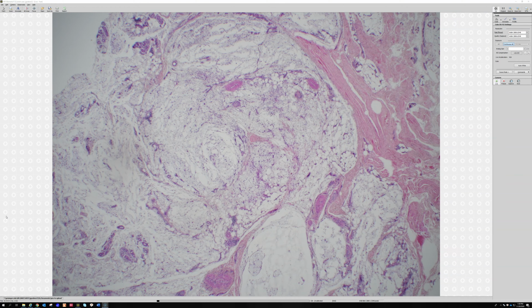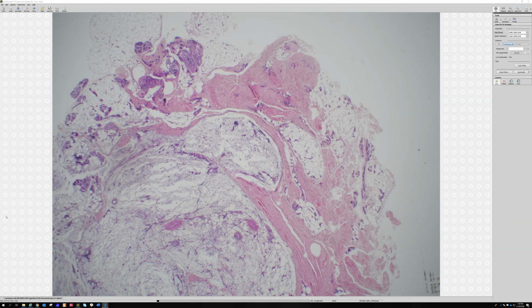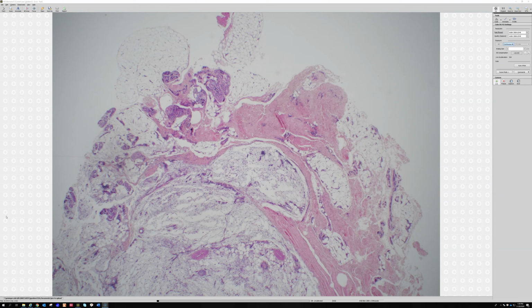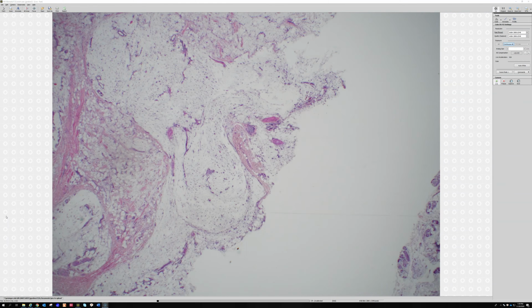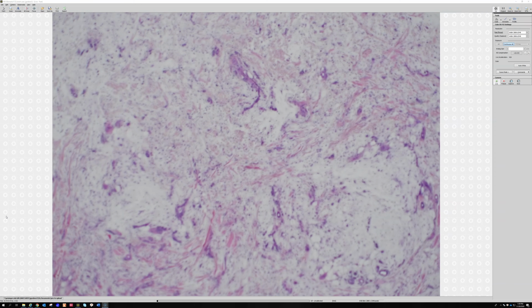Many sarcomas grow and push everything out of the way, but this is a sarcoma that's very infiltrative. It oozes with all that gooey myxoid blue background. It oozes in between. You can see it here getting in between some fascia, and there's some sweat coils down there. It spreads along the subcutaneous septa and along the fascia, and because of that, the surgeons, even experienced sarcoma surgeons, sometimes really have trouble clearing this tumor. They'll cut way around the mass, and the margins will still be positive. Because of that, it has a high rate of local recurrence.